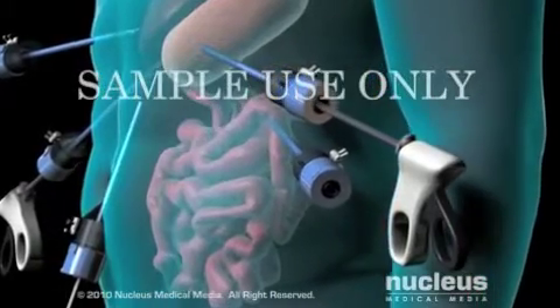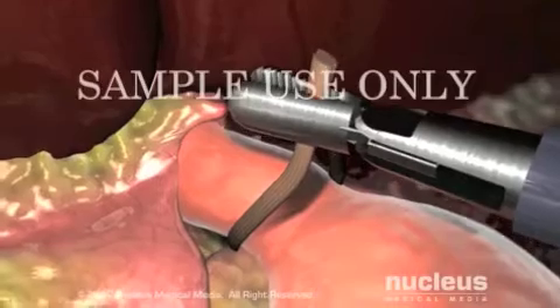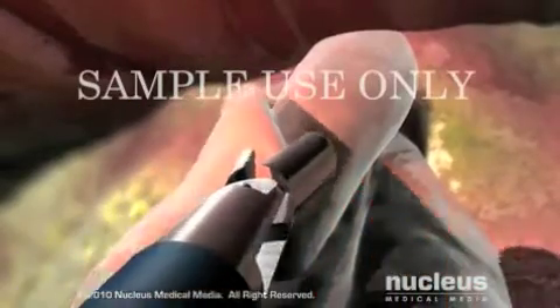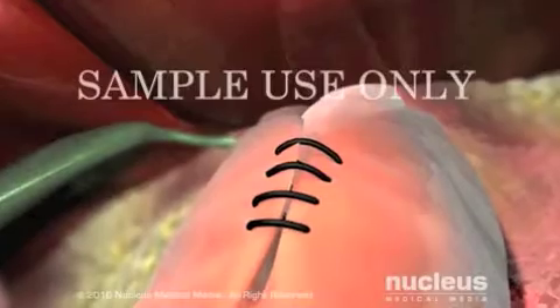Through the other incisions, your surgeon will use instruments to detach the fundus of your stomach from its surroundings, wrap it around your lower esophagus, and stitch it into place.